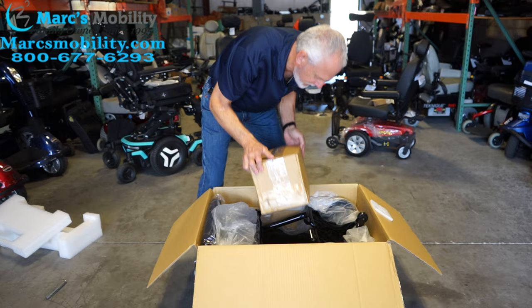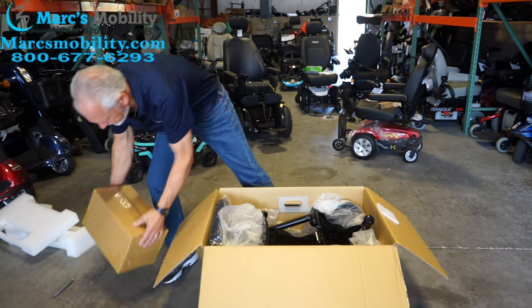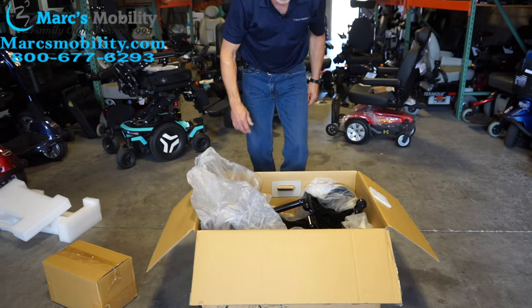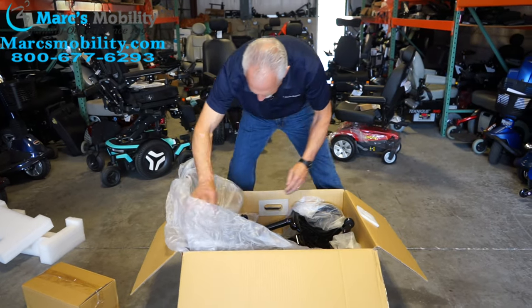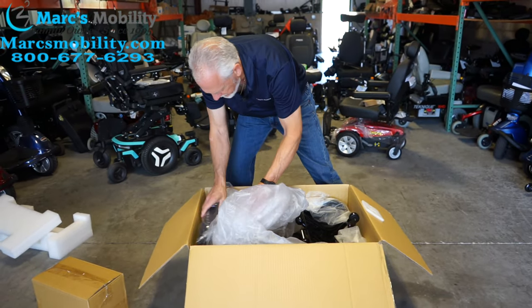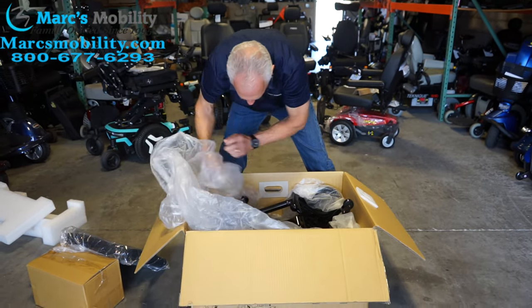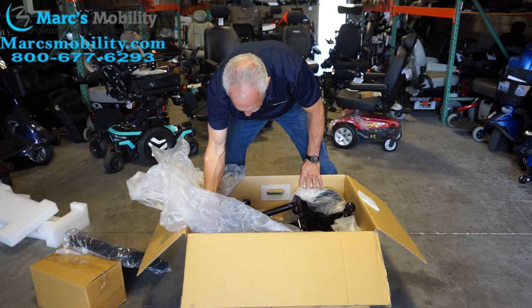Then there will be a box here — you'll take this box out. Then I guess we just take the chair out, the cushion, and now I will lift the chair out of here.